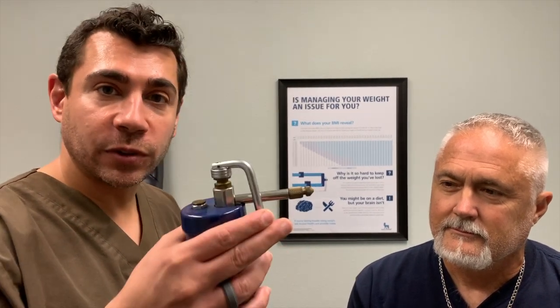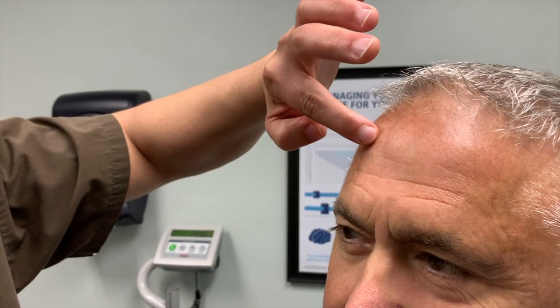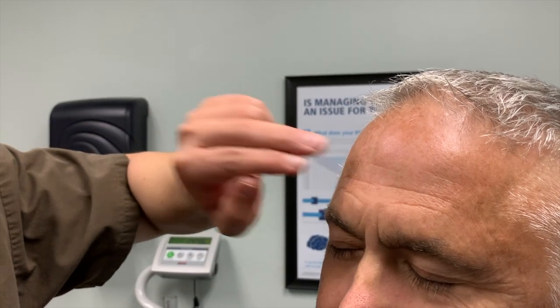Hi, this is Dr. Jonathan Youssef, Networking for Your Optimal Health. Today I'm going to be taking care of some actinic keratoses. If you're watching this video, you've either been told you have actinic keratoses or possibly a wart, and we're using liquid nitrogen to help freeze it off. This patient was kind enough to let us video this. He's got two small areas, very, very small, and they're flaking. You can almost see a little bit of a flake. He's come in because he's noticed that the flaking and the irritation keeps coming back, and it's been going on for almost a year. So we're going to freeze them.